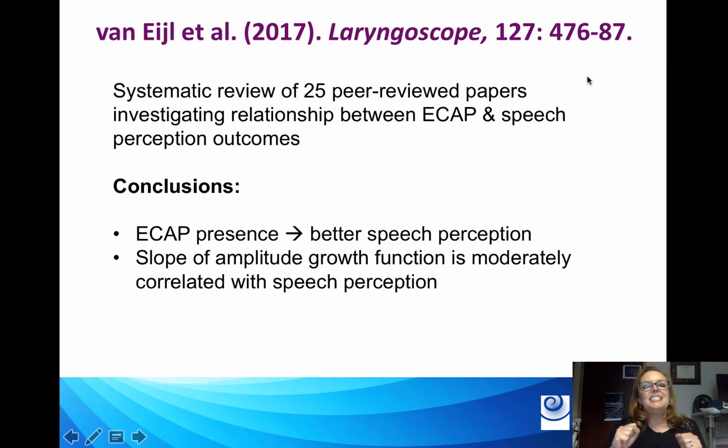Okay, we're almost done. So this is one more paper that I want you to just kind of think about. I'm going to just summarize it for you. It is a systematic review of 25 peer-reviewed papers that have specifically looked at what's the relationship between ECAPs and overall speech perception outcomes. There's a lot of papers out there, and there's conflicting data. So they were able to come up with 2 primary conclusions on the basis of really reviewing all 25 of these papers. Number 1, if the patient does have ECAPs, so physically we can measure them, these people do tend to have better speech perception outcomes as compared to people who don't have ECAP measurements, which is probably not terribly surprising.